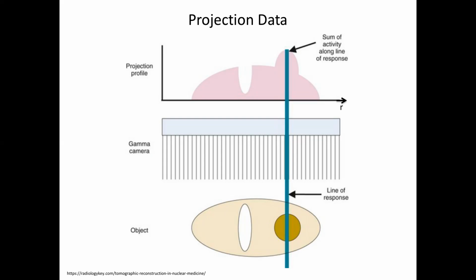Like if it's a dot, you can see where the dot is after 2 projections. But it's not patently obvious that for a continuous profile like this, if you took different profiles at different angles, you could make an arbitrarily high resolution picture, right? All right, glasses are fogging up here.